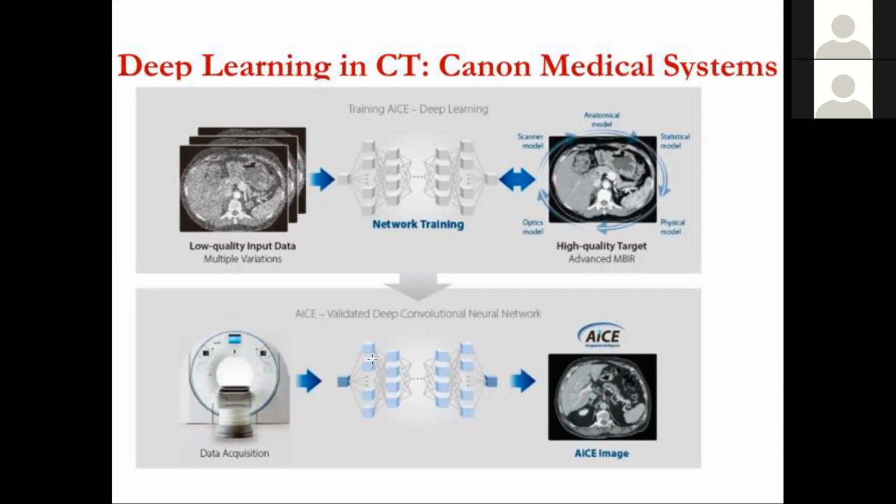So the idea is that your low dose speckles up, and you don't want that speckling. You want it to look less speckly, the way it used to. So we'll find the one that looks most like that. Which high dose image would it look most like? It finds the correspondence because you gave it one to match it up with, and it's perfectly matched. You can make it from the same data set.